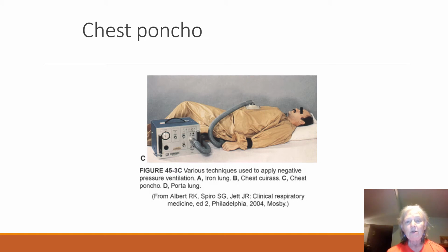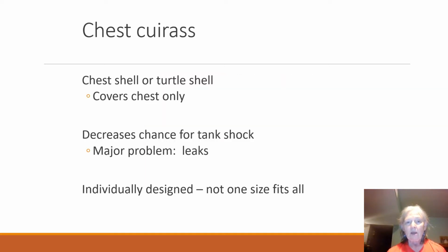This happens to be your chest poncho. You can see it's kind of comforting and warm and fuzzy. Chest cuirass for the most part. This is your turtle shell. They talk about that. It covers the chest only.